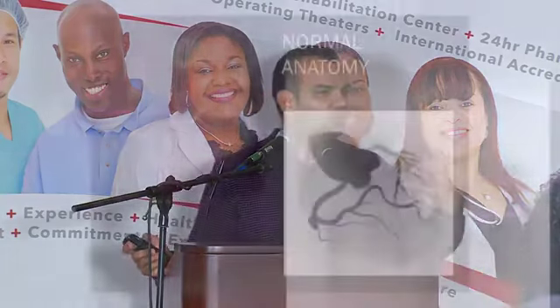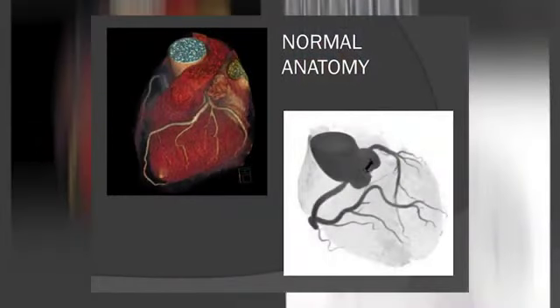Images can also be rotated, turned around in different planes. We can make negative images which look more like the catheter angio so that it actually suits what a cardiologist wants to review. So we can make images to their taste, to their angles, their choices. Let me show you some pathologies.